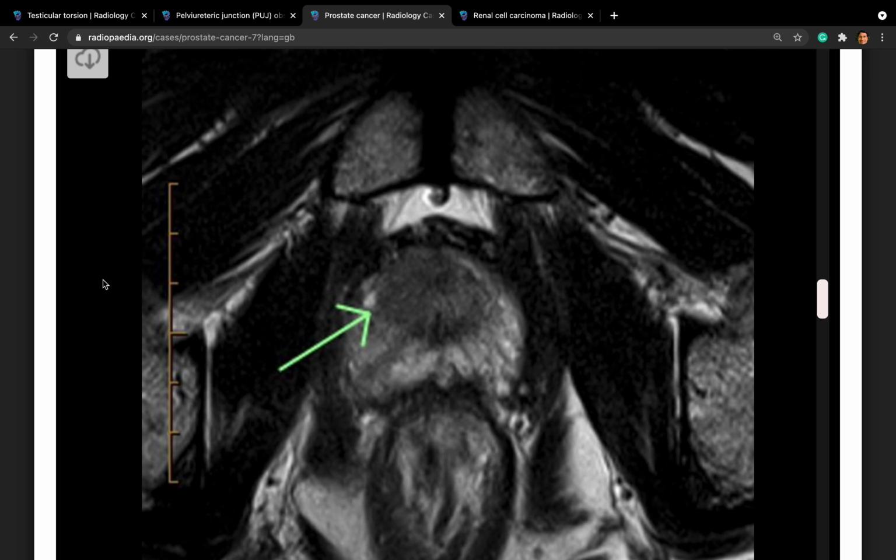Okay, so what are all the types of scans in the multi-parametric MRI? So multi-parametric means T1, T2, what other things? So T1 is the initial phase, and that's very helpful for the anatomy. Usually the fat is bright because it loses energy faster than water.